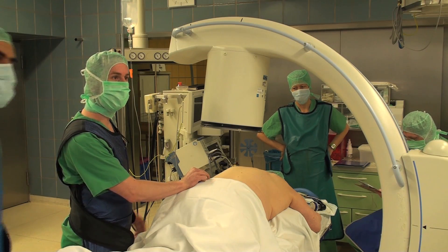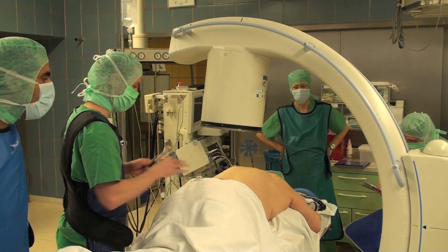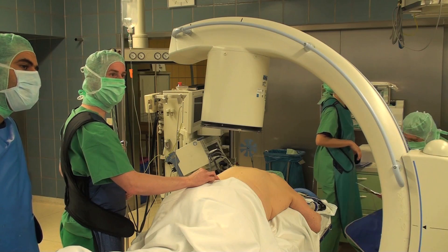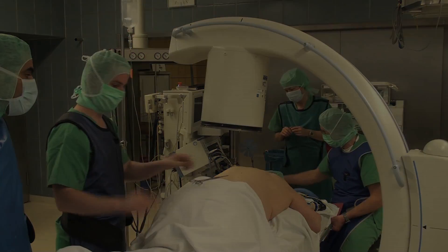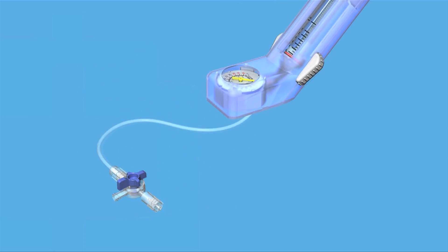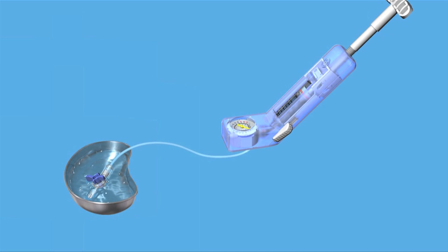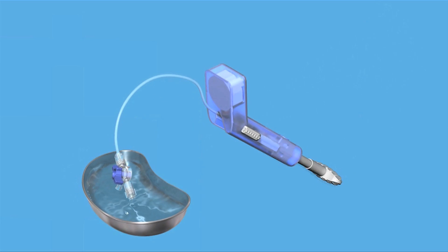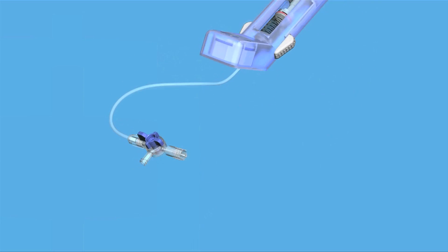Intraoperative view of the vertebral body L3. Under C-arm control, the eyes of the bilateral pedicles are being marked on the patient's skin. The 3D animation shows the function of the system. First, the inflation system needs to be filled up with a mixture of saline solution and contrast medium. Be careful that no air is in the system. Starting procedure with a K-wire transpedicular.